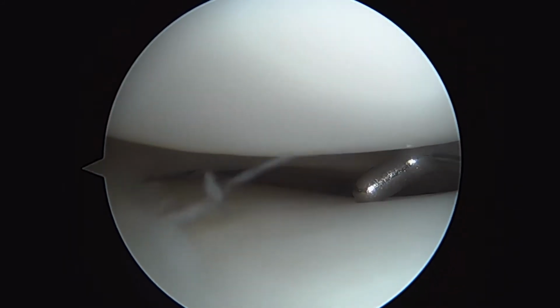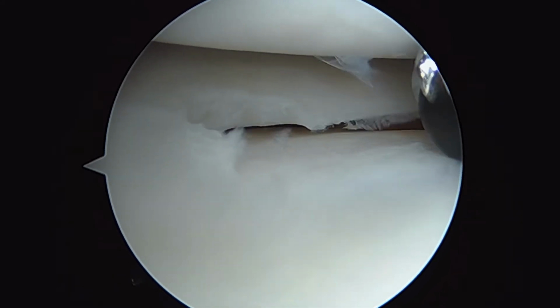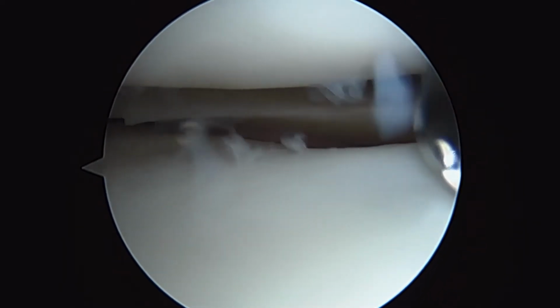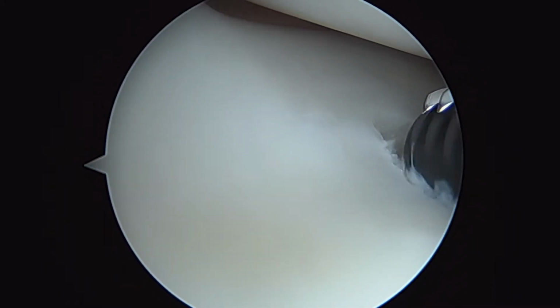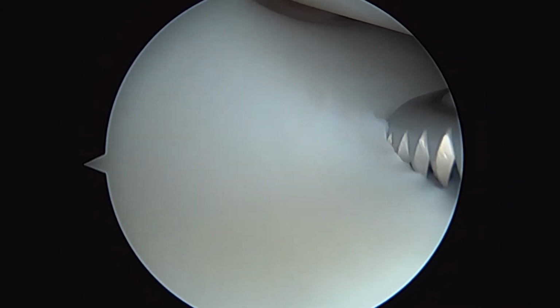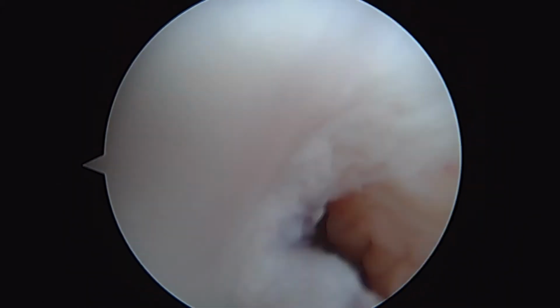Can you get me a straight basket? The smallest one you got. We'll show you some more in a little bit. I just wanted to show you how little of the meniscus we had to remove. That should be stable now. We'll polish that, fine-tune it a little bit, but we don't want to injure the cartilage at all. And you can see the compartment's a little tight, so we're being very careful here. Push down. And work on this anterior portion just a little bit more. And I think that's pretty much got it. So we will look at the patellofemoral joint in just a minute here.